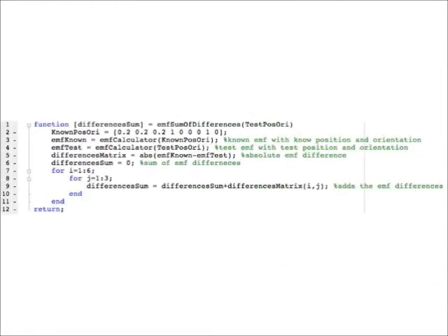The equations for calculating the EMFs are input into the optimizer parameters in the form of a Matlab function called EMF sum of differences. The function calculates the sum of differences between the EMF calculated from the actual position and from the measured position. The function is basically a measure of error.